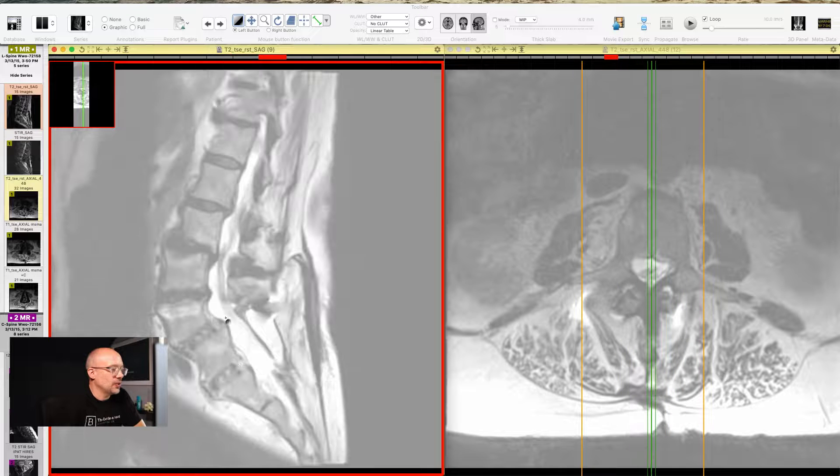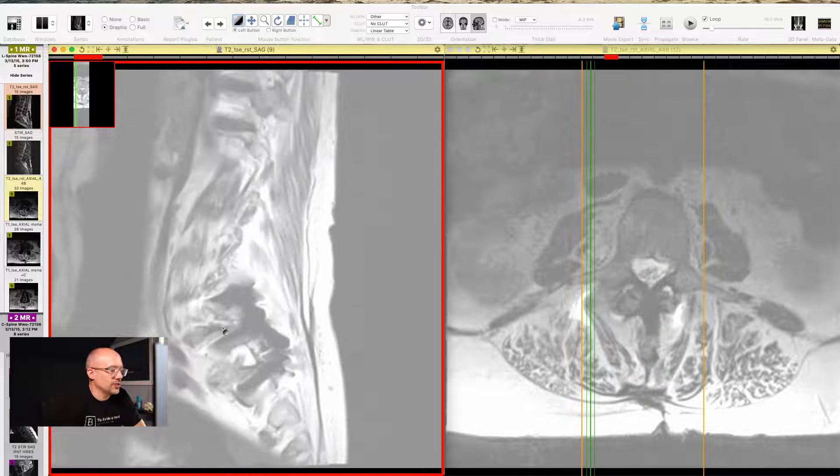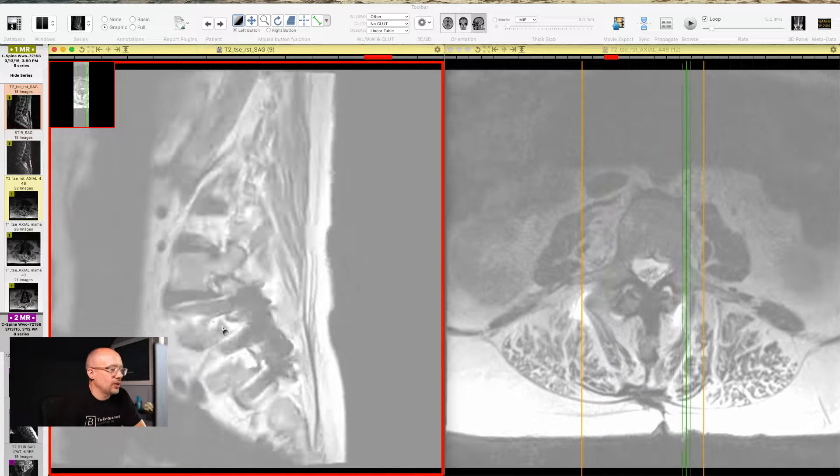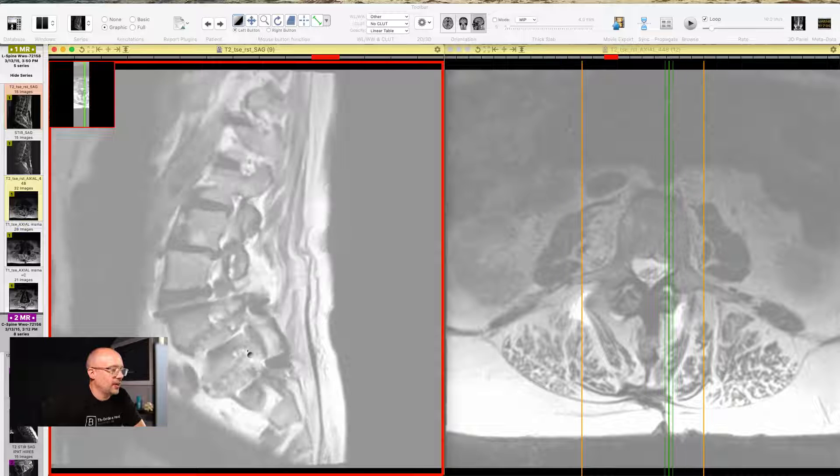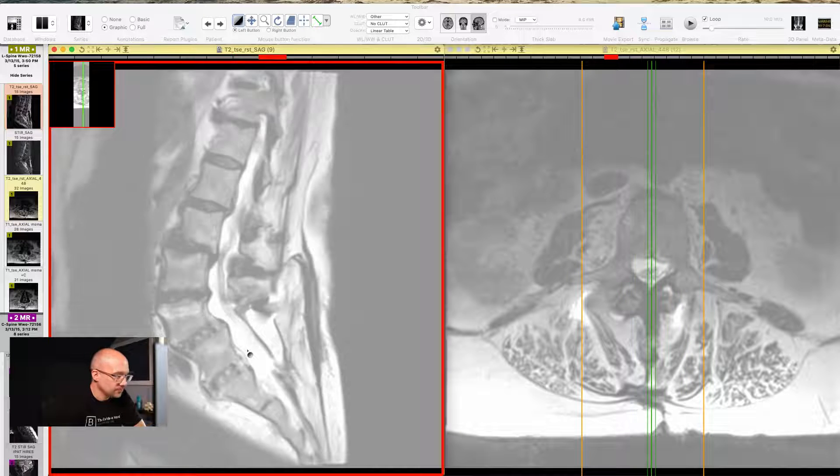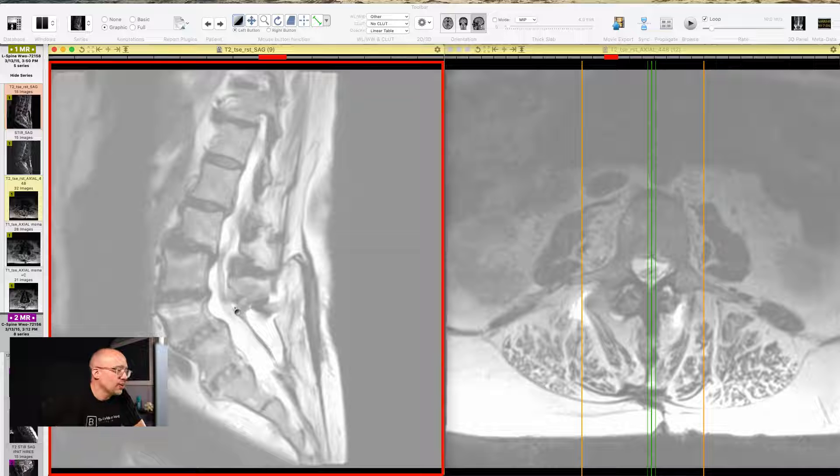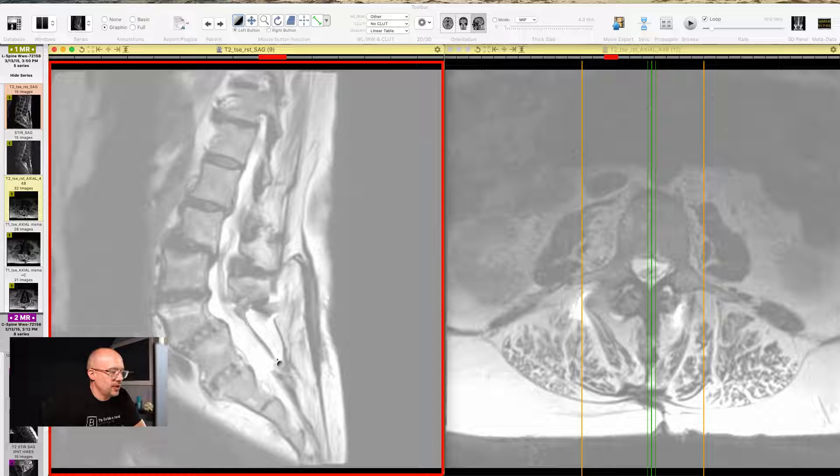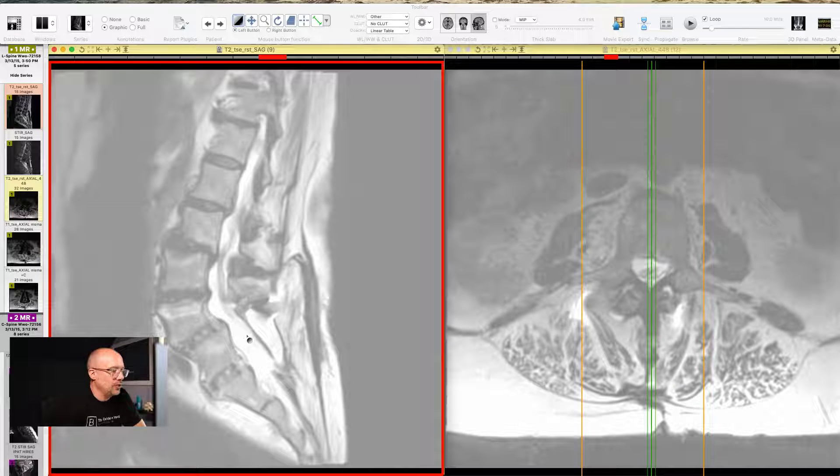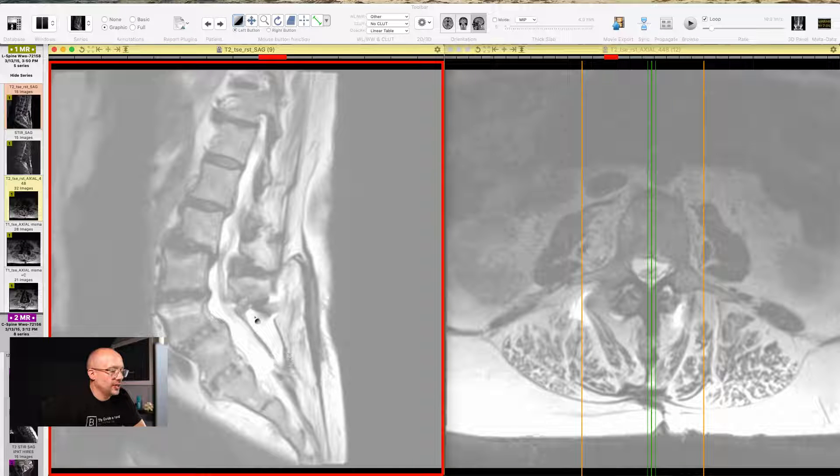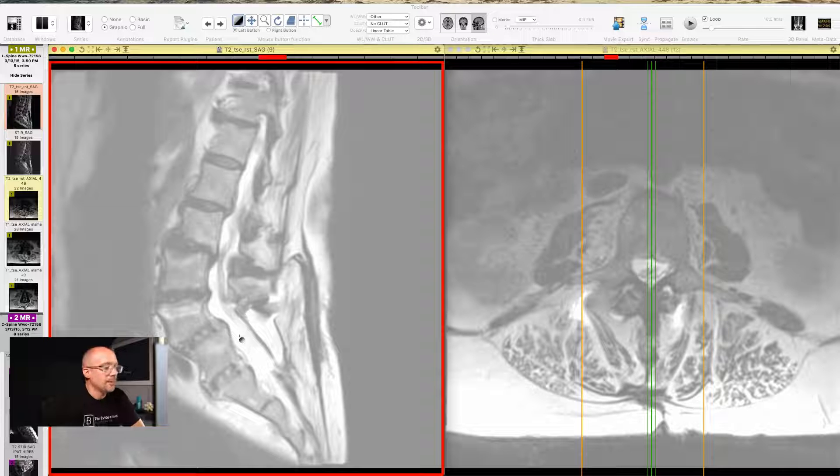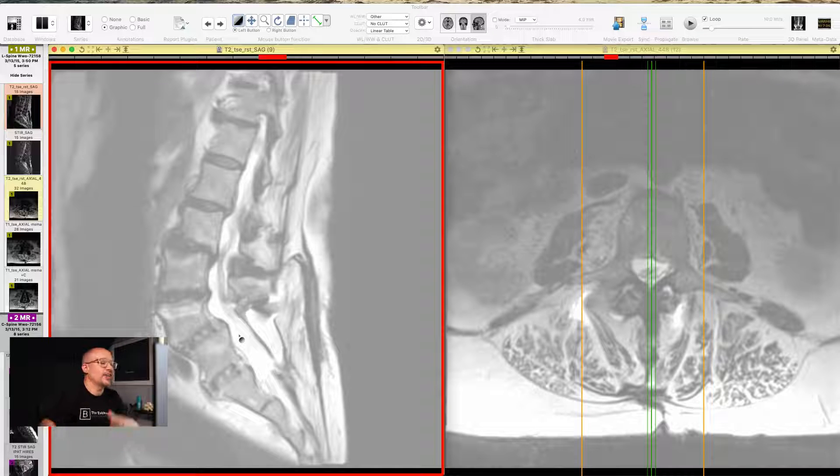So that's what we are seeing right there as we go to the sides, a big mess of hardware at L4, L5, and S1. Now one other thing you might note is there is this big weird pocket of white stuff hanging out behind where the spinal canal is. That is a large fluid collection.